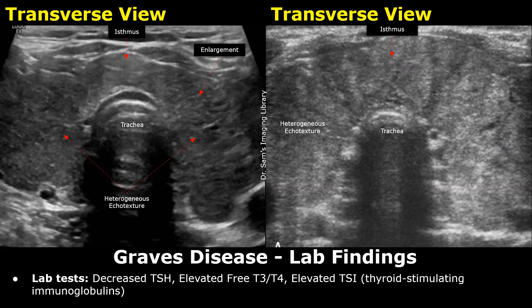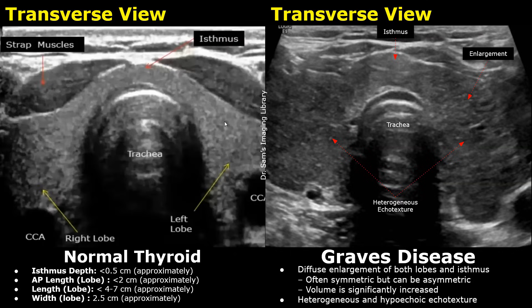We will compare the normal ultrasound appearance of the thyroid with its appearance in Graves' disease patients. This is the normal thyroid in transverse plane — it has a hyperechoic and homogeneous echo texture. These are the right and left lobes; the isthmus is in the middle. The normal thyroid measurements are given here. The right side shows a thyroid affected by Graves' disease.